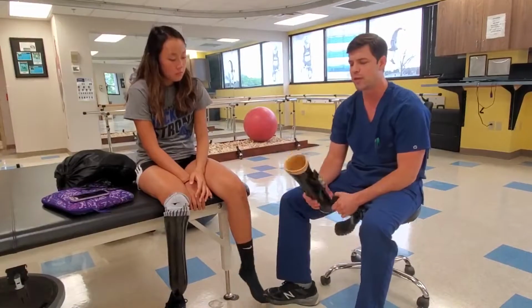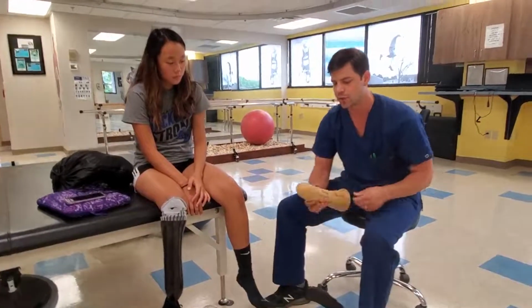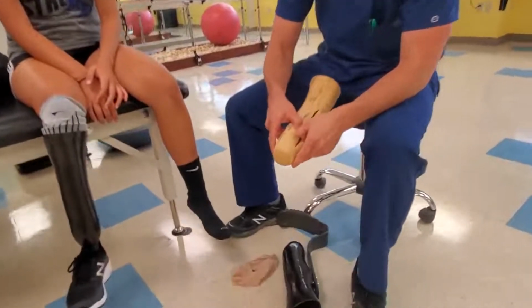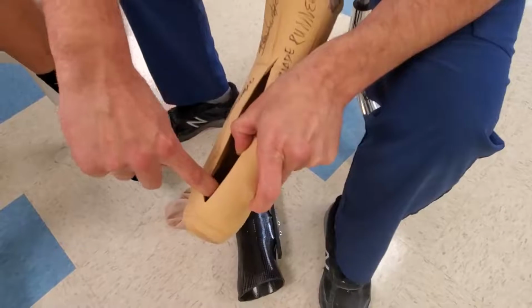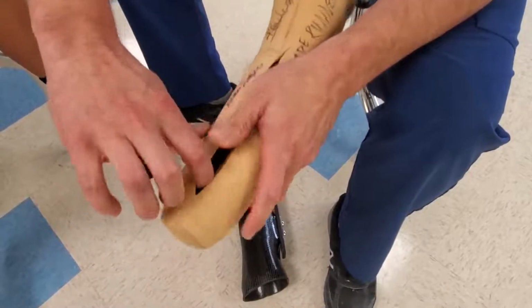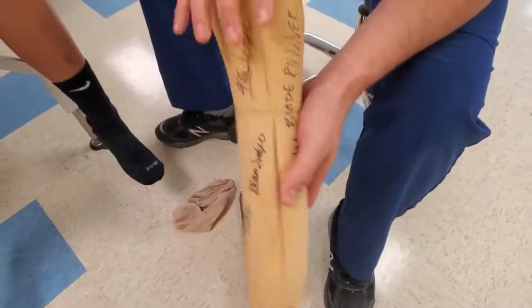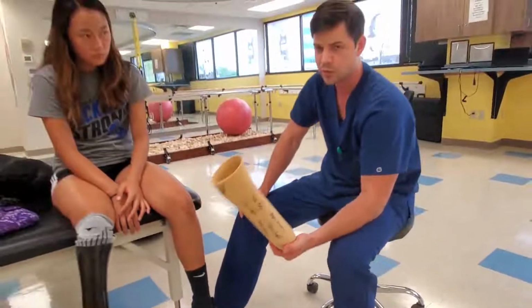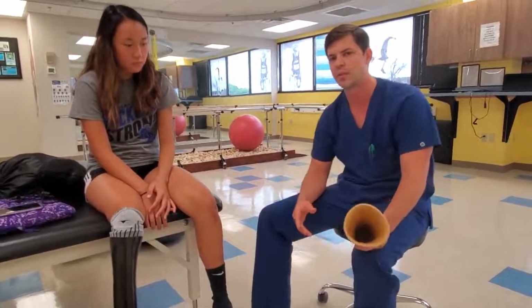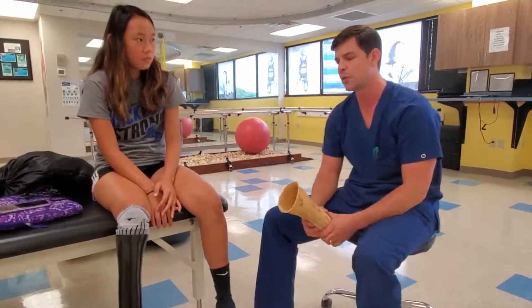The main issue she was having is, one, in this P-light she was unable to achieve total contact on the bottom of her P-light. So this is an expandable wall with the slit here, but her residual limb was getting about where my finger was at, and she wasn't getting all the way to the bottom, so all this was just kind of caving in on her. And because the socket trim lines weren't in the area that they had been in for close to a year, it created a lot of skin breakdown and skin irritation on the posterior aspect of her calf, which we've been trying different socks.